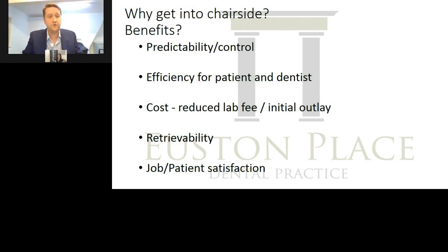You've got the actual crown file stored on there. And you could potentially even just use that crown file, export it as an STL file, and then have it made in a different material. If, for example, you had a bruxer, you made an EMAX, it broke, and you wanted just to make that crown in zirconia or something, you can then send that STL and get that milled by someone else who is doing zirconia milling if you're not doing it in-house.